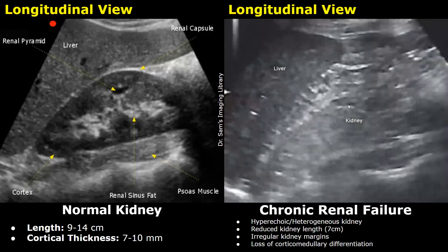This image shows chronic renal failure, the final stage of chronic kidney disease — stage 5. The kidney is barely visible and mostly appears hyperechoic and heterogeneous with a reduced size. It also has irregular margins, and there is loss of corticomedullary differentiation.